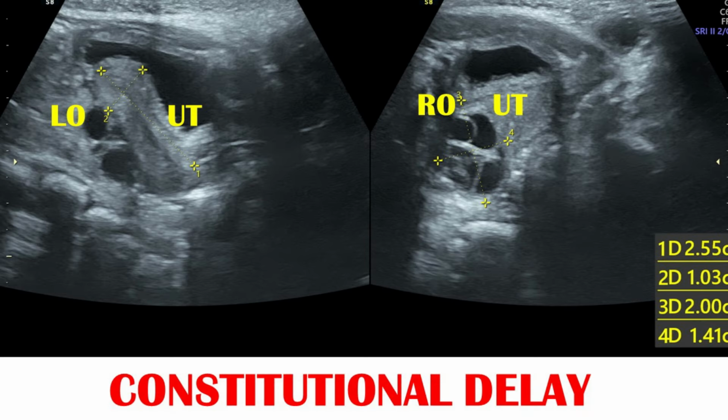The fourth one, you can see a smaller sized uterus with visualization of good ovarian follicles, and the ultrasound was done transperineally because the uterus and the ovaries could not be assessed very well with the distended bladder, and it was looking very thin. Hormonal analysis was correlative for prepubertal age group, with family history of delayed menarche of her elder sister and also of her mother. After 1.5 years, she had usual menarche, and so the final diagnosis is constitutional delay of puberty.